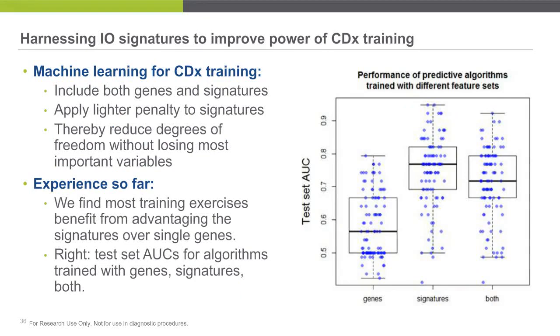A major goal of a lot of studies in the translational setting is to not just understand the biology behind response or non-response, but to create a predictor of response, to have a diagnostic that could exclude non-responders from a clinical trial, for example, or identify the patients where your drug is going to benefit patients more than the standard of care. So in this case, we also find that our signatures end up contributing statistical power and enabling success. This is a simple, not quite simulation study.